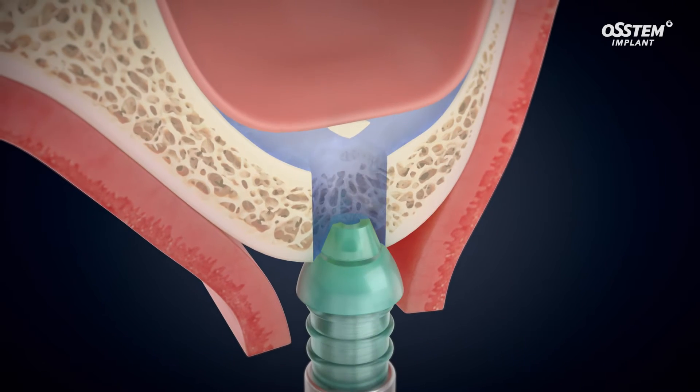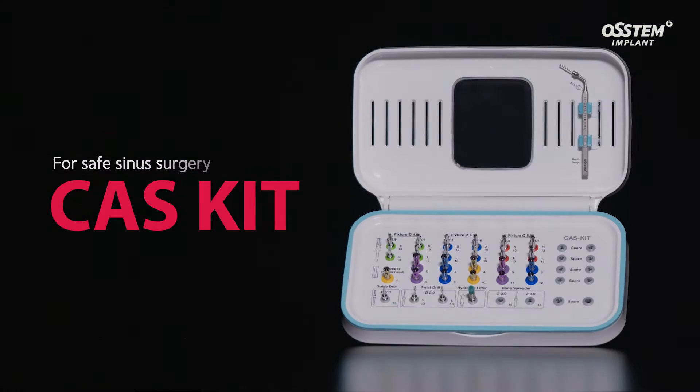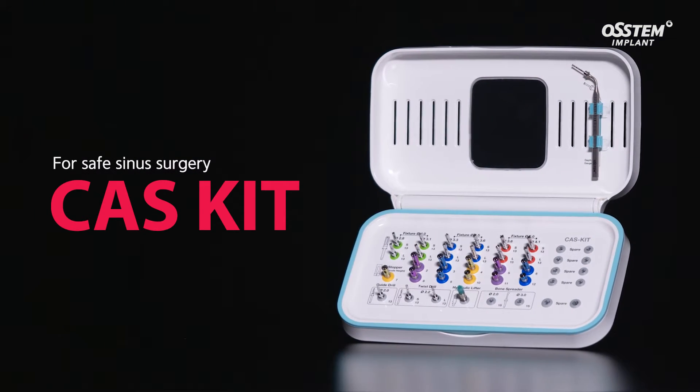Introducing the CAS kit — the Crestal Approach Sinus Kit — that safely lifts the sinus membrane with a hydraulic lift system.